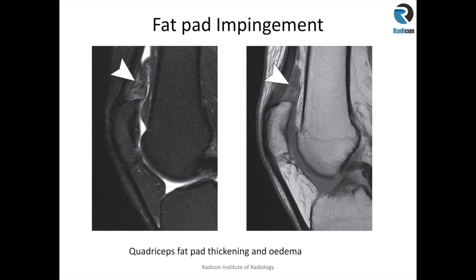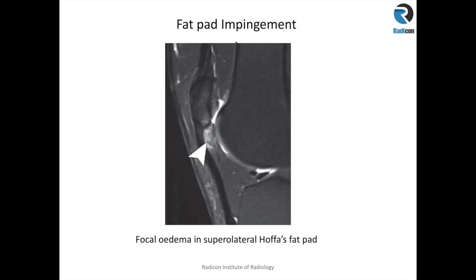Fat pad impingement — there are a couple of more common types. The quadriceps fat pad: normally it has the same signal intensity as the rest of the fat around the knee joint and is not thick. In fat pad impingement, you get quadriceps fat pad thickening, edema, and signal change suggesting impingement, which may be the cause of the patient's anterior knee pain. Another cause of anterior knee pain is superolateral Hoffa's fat pad impingement, also known as patellar tendon-lateral femoral condyle impingement, where you get edema, reaction, and thickening in the superolateral corner of Hoffa's fat pad as demonstrated by the arrowhead. You can also see mild edema in the inferior pole of the patella, which may be mechanical or stress induced.